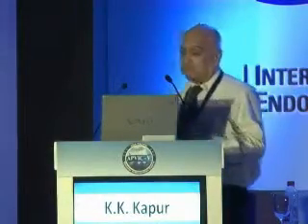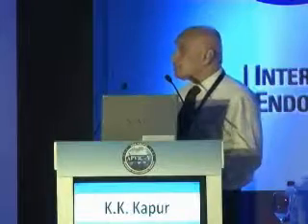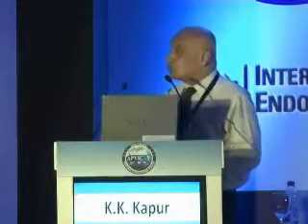So this is acute DVT. Now the signs of deep vein thrombosis therefore are absent or reduced compressibility. This is the most important sign of a deep vein thrombosis. And then of course you can sometimes see a clot of varying echogenicity. In the acute DVT you will not be able to see a clot very well because it is absolutely echolucent.